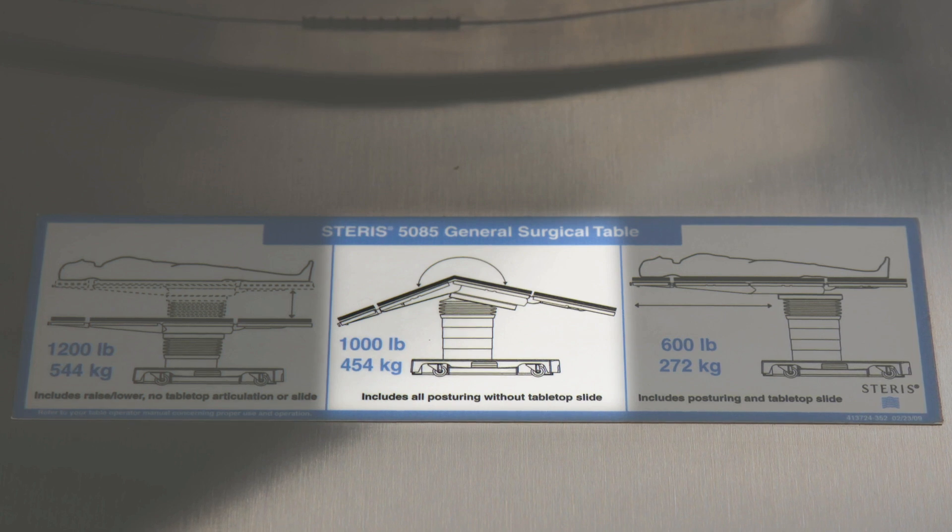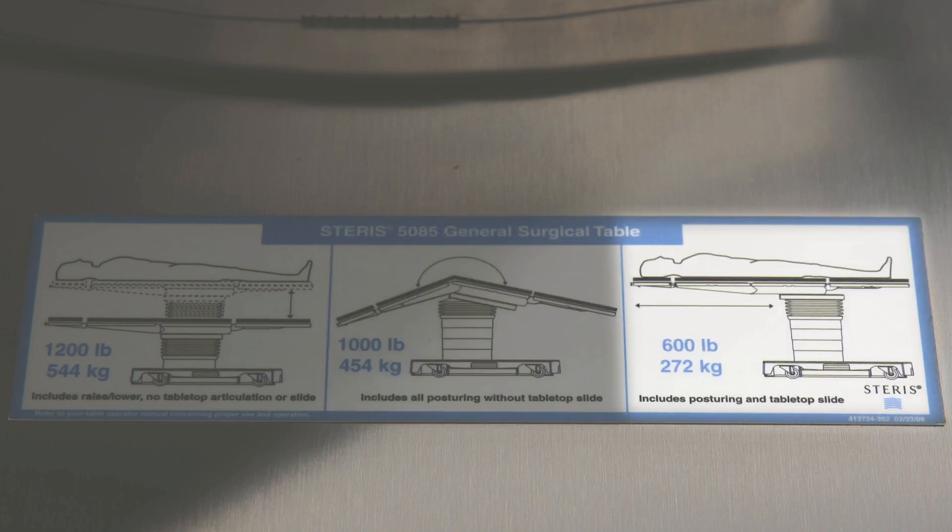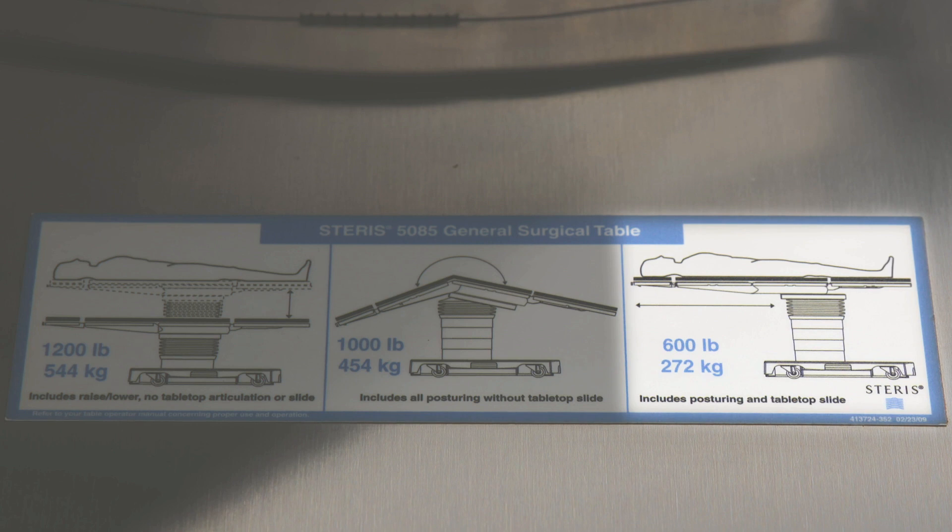You can utilize this table with all articulations as long as the tabletop is centered over the column, up to 1,000 pounds. The last number is 600 pounds — you can utilize this surgical table in full articulations, even the slide to head and to foot, for a patient up to 600 pounds. So let's look at the hand control, because it's easy to use but quite different from the 3085.